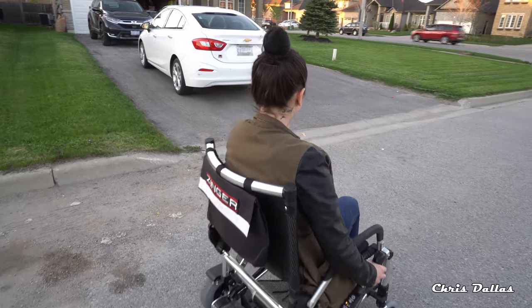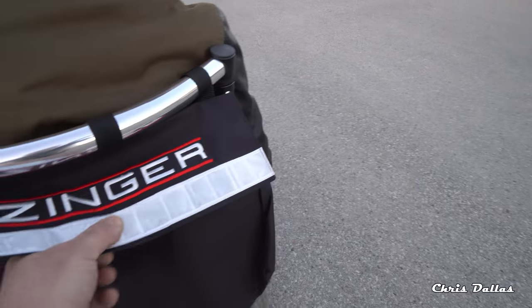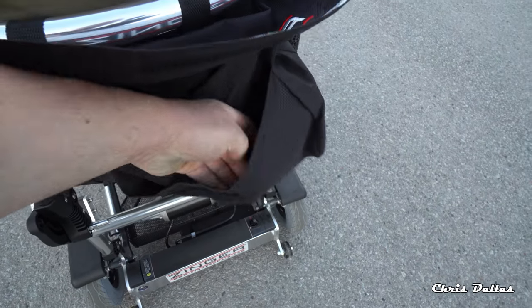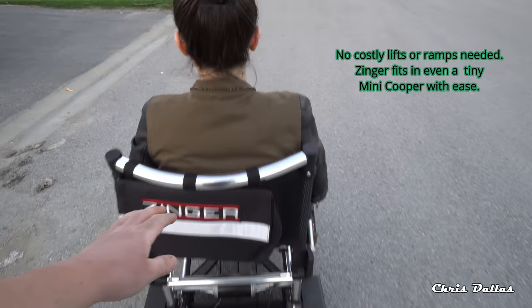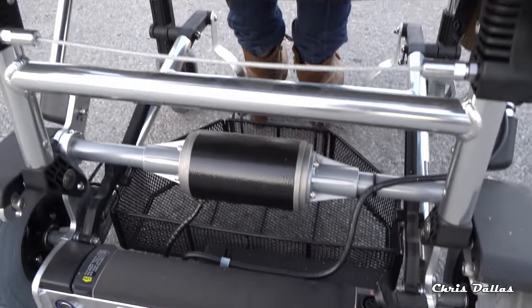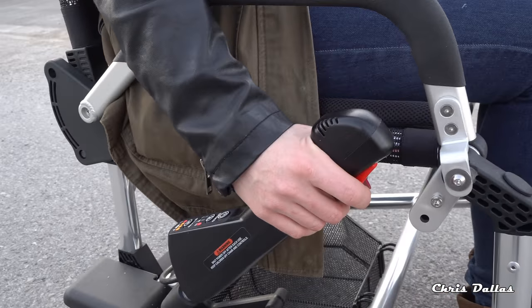Over here you see the Zinger bag. You can put a laptop or something in the back here — it's Velcro. You can see another Velcro here. You can utilize this as a laptop bag. And then at the bottom you have a little basket, as you can see. You can put a shopping bag or whatever it is you want underneath.